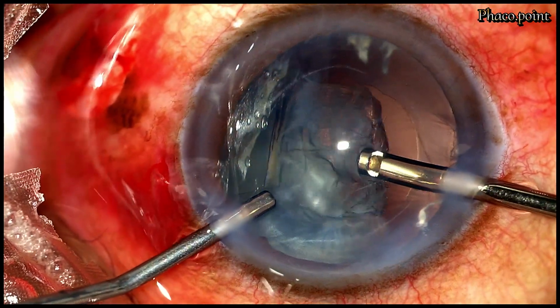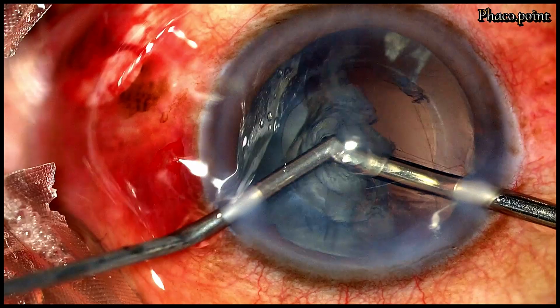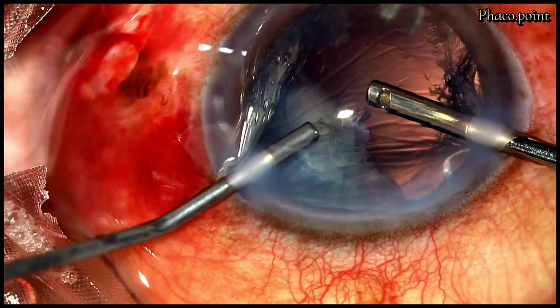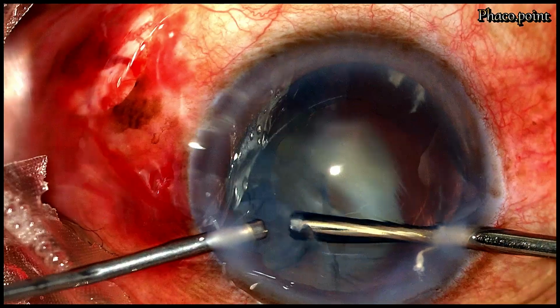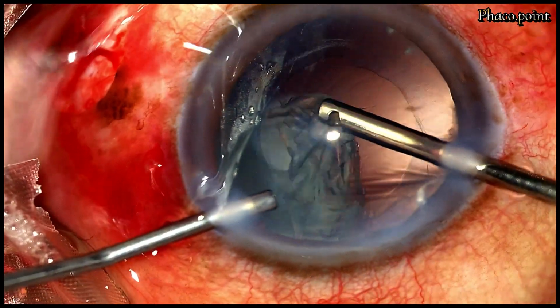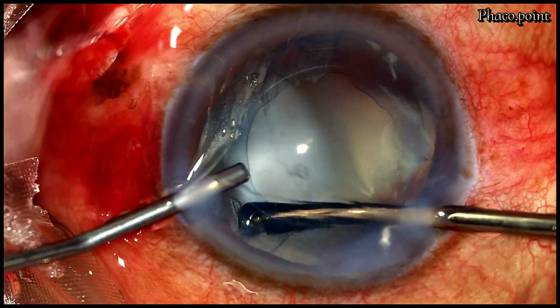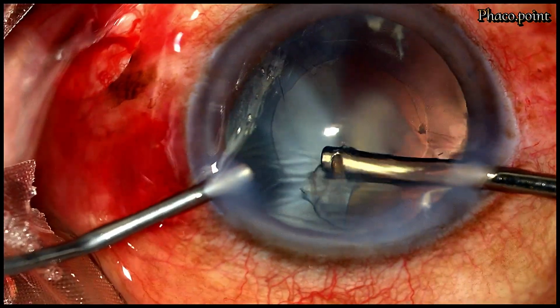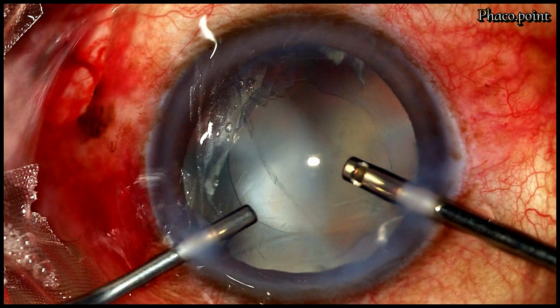The two very important things that we need to avoid during this step is one, accidentally holding on to and pulling on the vitreous, and second, accidentally damaging the anterior capsule. You can see how with care and caution, we've been able to completely remove the entire cortex from behind the anterior capsular rim without any accidental loss of cortex to the vitreous. At this point, you can see the large rent in the posterior capsule.